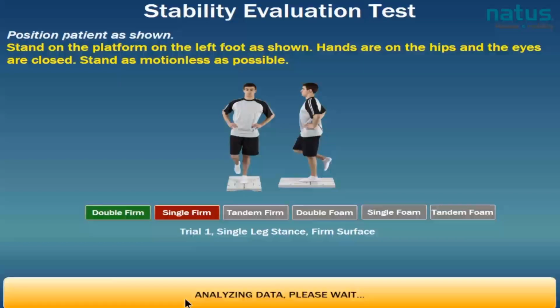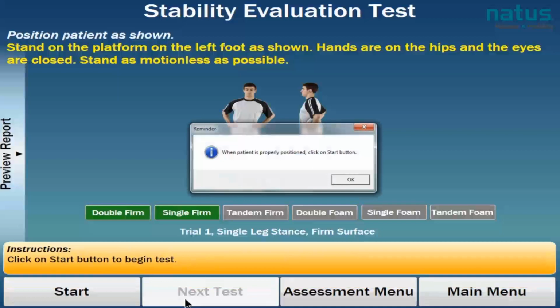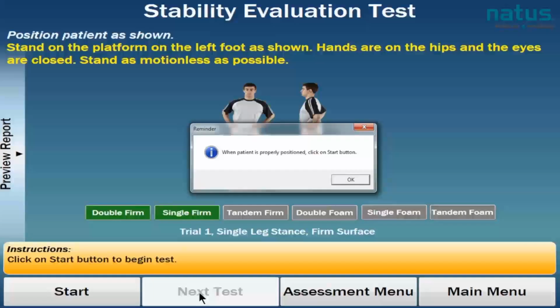What you'll notice about this stability evaluation test is that a fall is not necessarily a fail because the computer has measured the length of time he was able to balance. These conditions are very challenging, and even normal individuals can lose their balance on these conditions. I have a message on the screen that says you can reposition your patient. Anytime you mark a trial as a fall, you have the opportunity to make sure your patient is repositioned for the next trial. I click on OK.